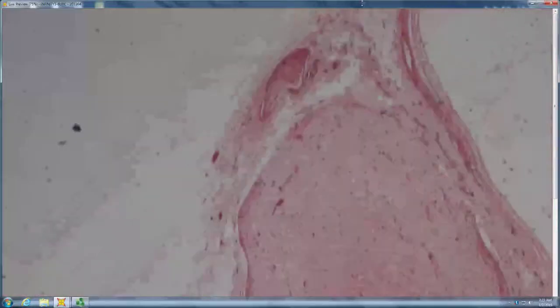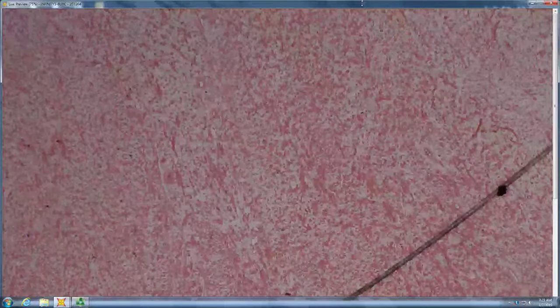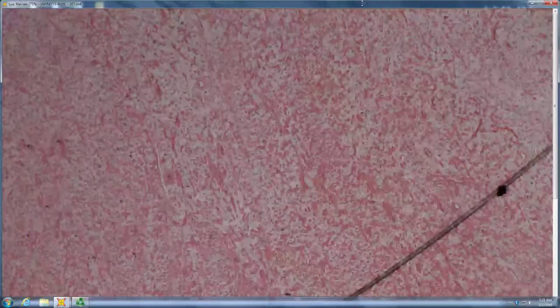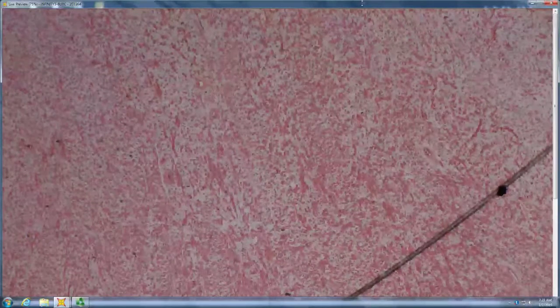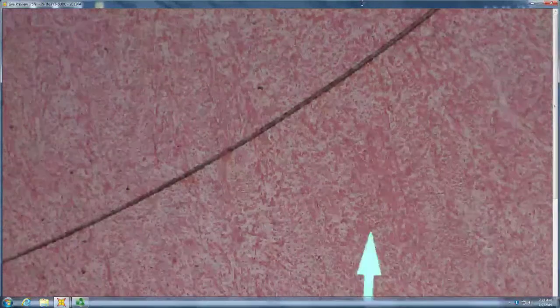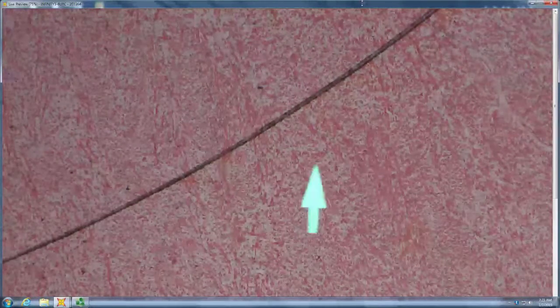So that is one thought, that it would be a schwannoma with only Antoni B tissue. That would tend to be pretty edematous across the entire thing. This has edema but also has intact fascicles within it. Never get that in a schwannoma.